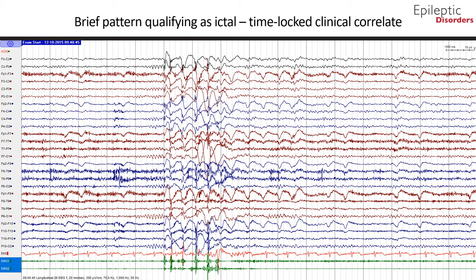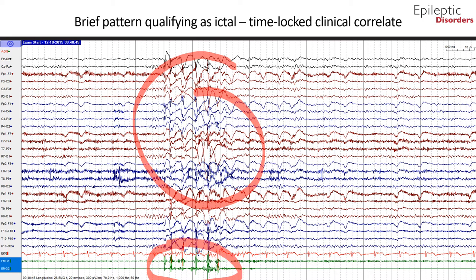In this EEG, you can see spike wave activity that is time-locked with myoclonic jerking movements, as outlined by the red circle and star below in the green EMG-1 and EMG-2 channels, where each myogenic spike is phase-locked with a spike wave complex. Although this pattern is less than 10 seconds in duration, the fact that it is time-locked with clinical manifestations qualifies it as an ictal pattern.